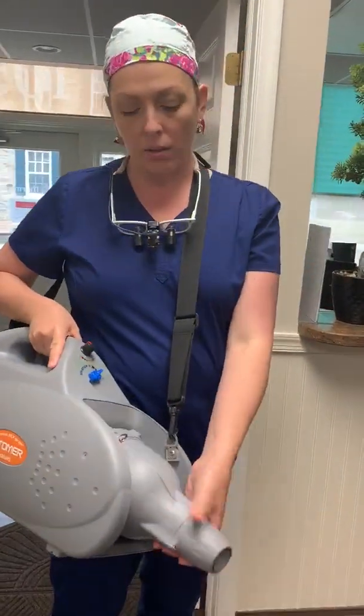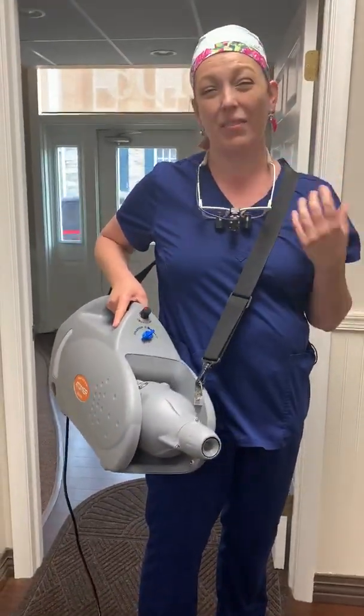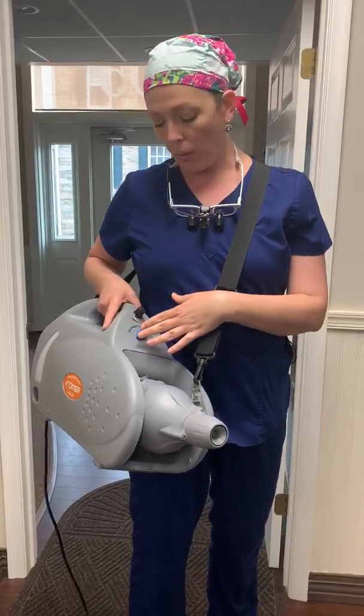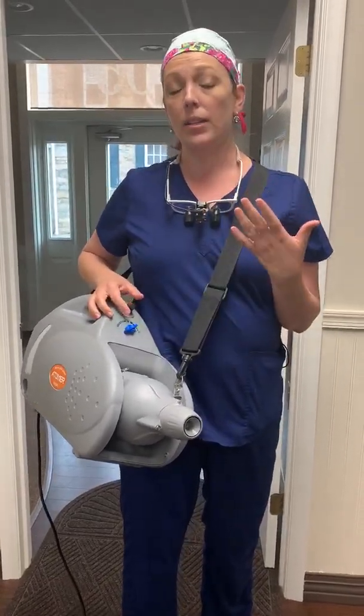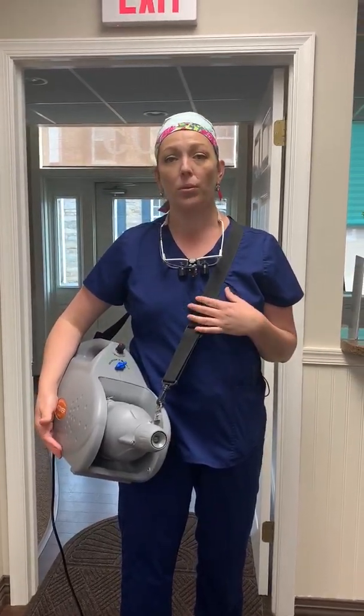The nozzle can point up or it can point down. It does have a little bit of sound — it kind of sounds like a vacuum. We will fog when there are patients in the office; we'll fog at lunchtime, and if there's someone still checking out we'll let them know what we're doing. We work from the back of the office to the front, so by the time we're at the front the patient's usually been dismissed. It's electrolyzed salt water so it's safe to be around.